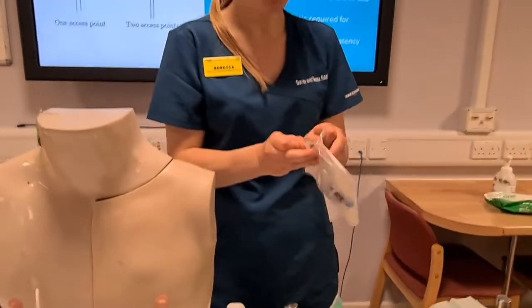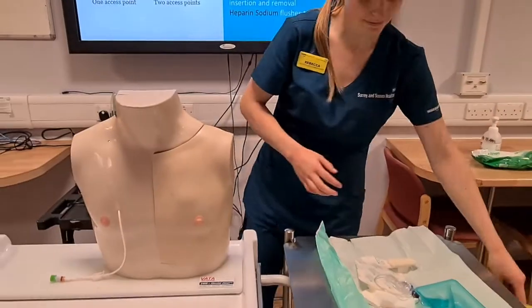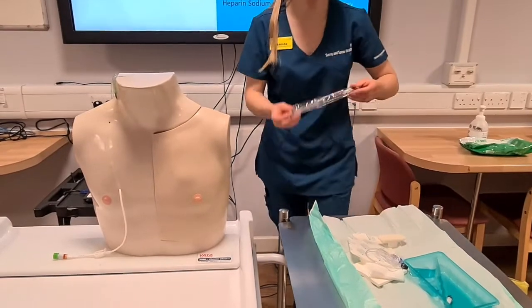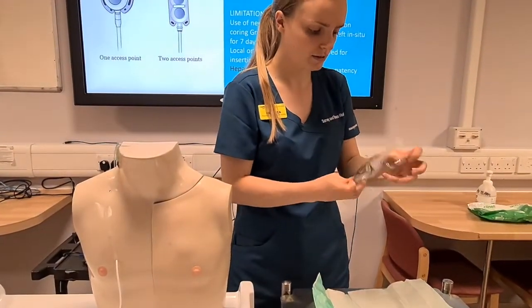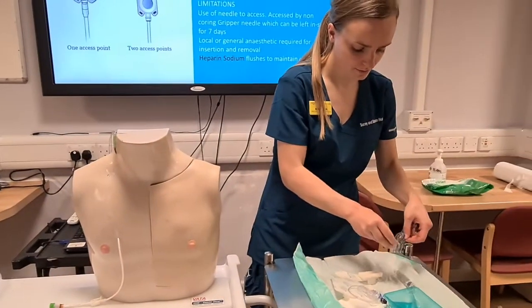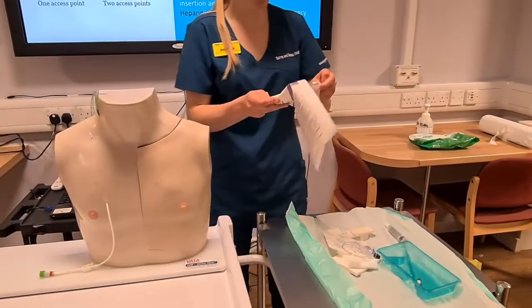So I'm going to open this up onto my sterile field. And throw that away. I'm going to get my flush, placing this onto my sterile field, and my sterile gloves.